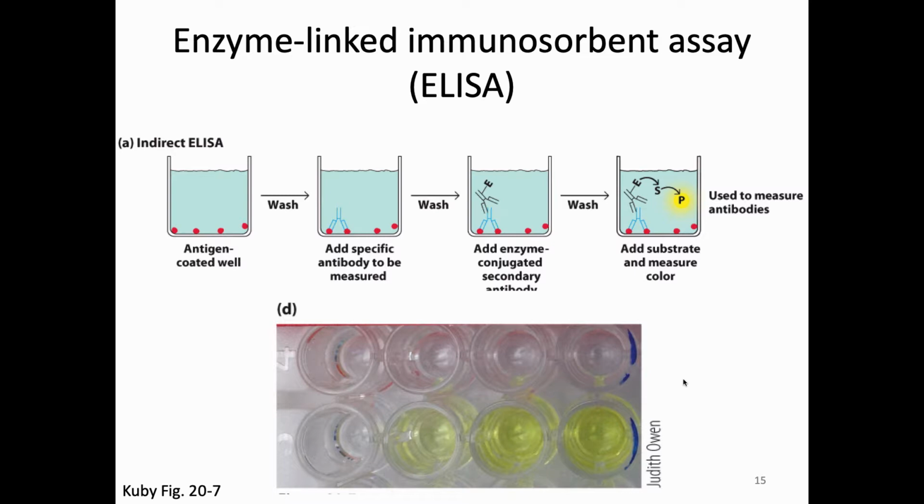What they will do is they will stick antigen in the plastic well. Before we stuck antibody, here we're going to stick antigen in. And then we're going to put your blood sample. If you have HIV, you'll have antibodies against it, and they will bind to the antigen. If you don't, then nothing will bind to the antigen. And then we will use another antibody that will bind to the constant region of the first set. We will use an anti-human. Perhaps we will use mouse anti-human or goat anti-human or something that just binds to the constant region of human antibodies, because you are a human, so antibodies that come from you are human antibodies. And that one will have your enzyme, will convert the substrate, will give you a color change.